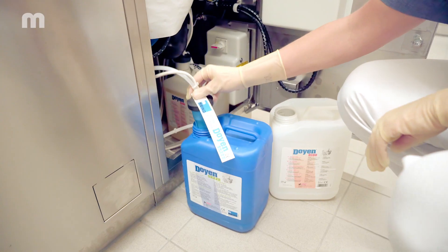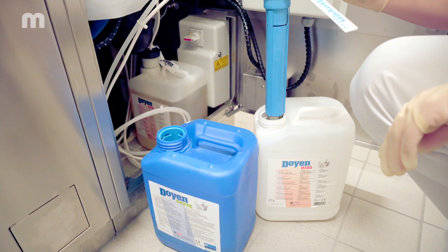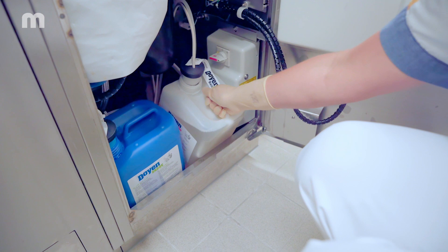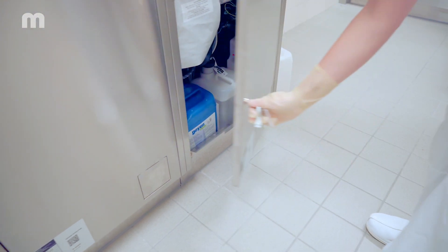If you are using detergents and/or rinse aids from Myco, the Myco Chemcode system ensures that you never accidentally confuse the detergent with the rinse aid. Myco — the clean solution.